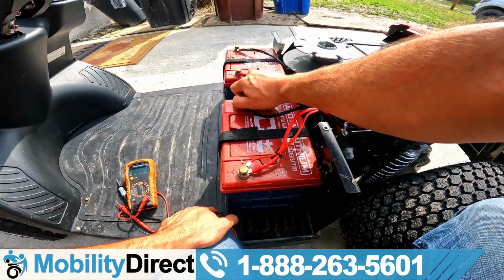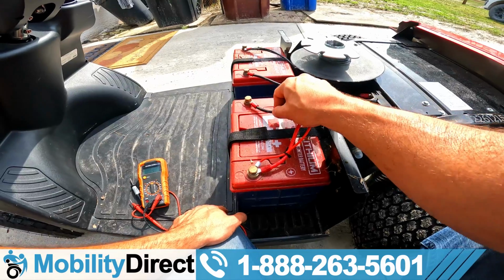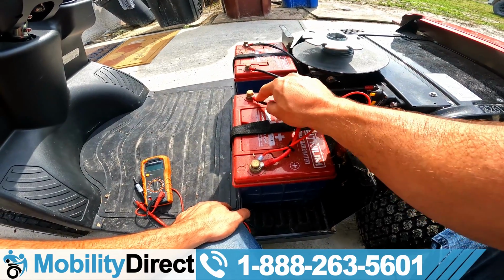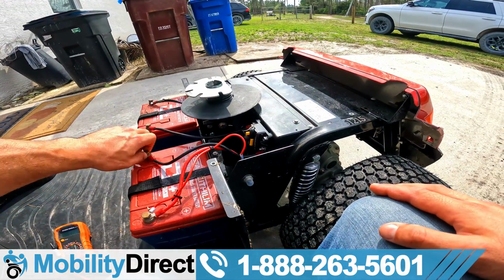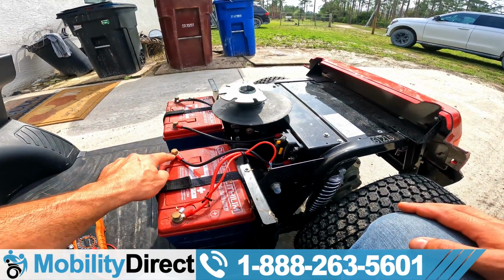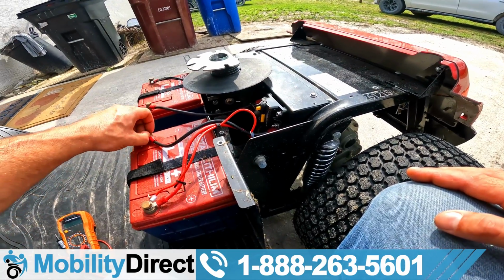And there's really nothing else to do here except tighten that up, because when it's wiggling like that and you're going off-road, guess what? You're getting an intermittent connection on the volts that it needs. So what I'm gonna do is tighten that up. It looks like maybe we're missing a washer, and that's why. So I'm gonna go ahead and change that out.